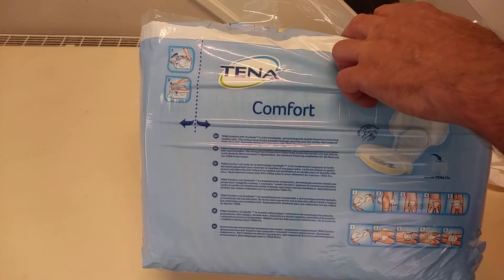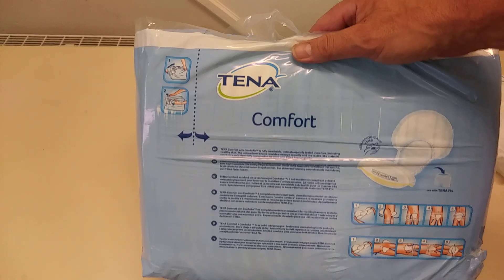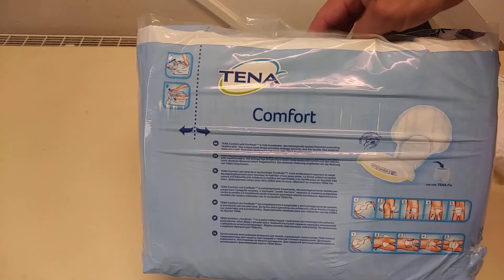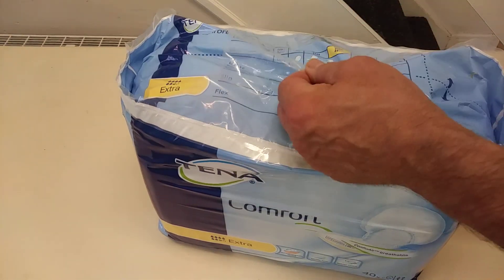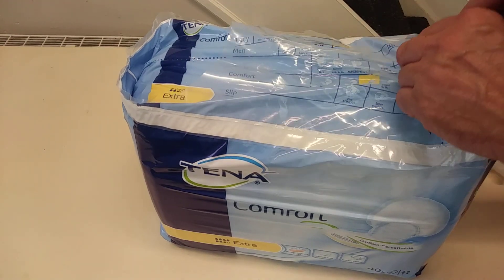These are designed to be used with Tena Fit, which are the pants. It gives you the full instructions on there, exactly how to use them. This has got an extra rating for more absorption, obviously.